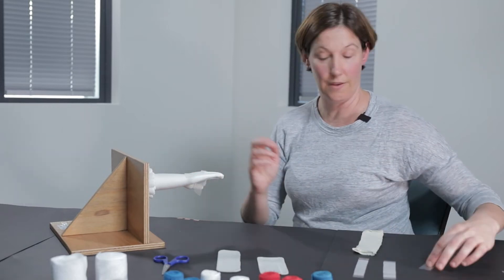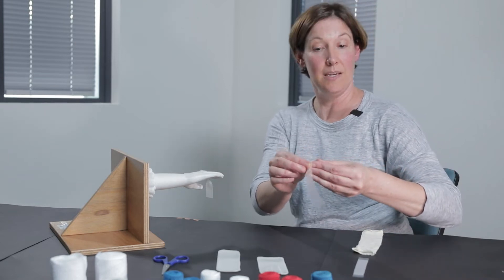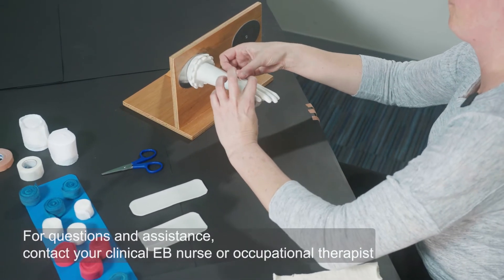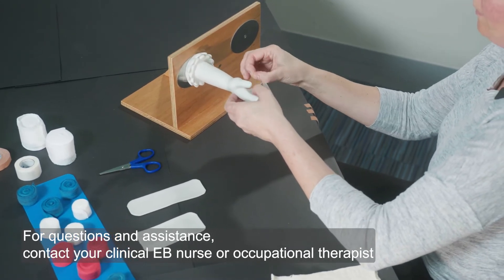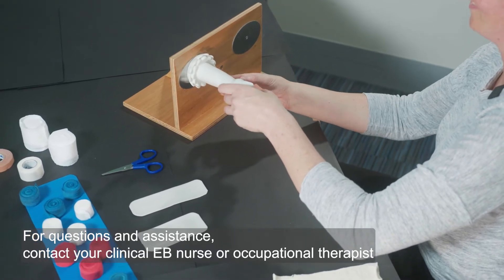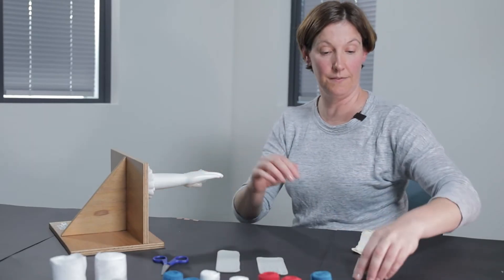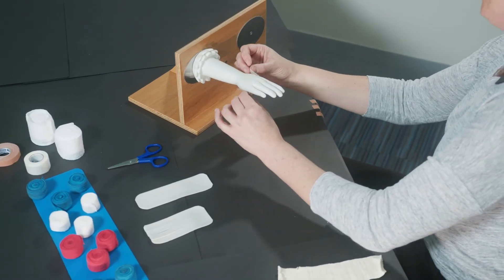If you need any help with this or need to review any of the techniques, please reach out to your EB nurse specialist or occupational therapist that you work with on your clinic service. I'm just laying down this mesh layer — it likes to sometimes peel off, so do your best to stick it there; it is a bit sticky. Keep it nice and flat. We're adding a layer to each web space including the thumb.